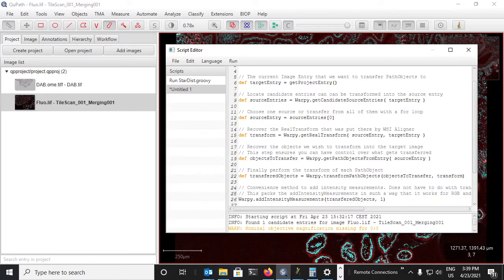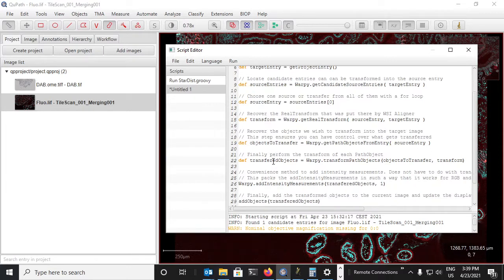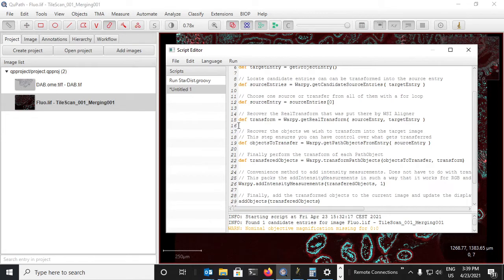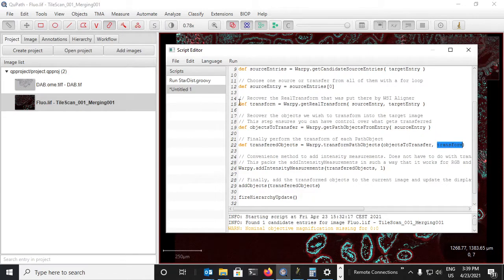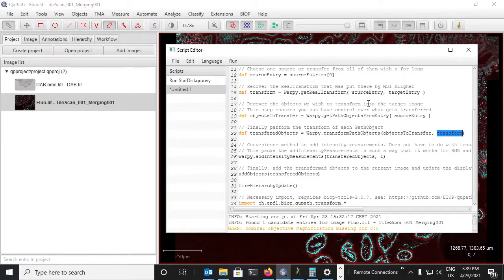Then we can decide to pick up all of the objects that are currently on the source image, so the DAB. And finally we can transform all these objects using the transform that we picked up on line 15 here. And then we add a convenience method that allows us to, on top of transferring the objects with all the measurements, add intensity measurements again to the newly transferred objects.